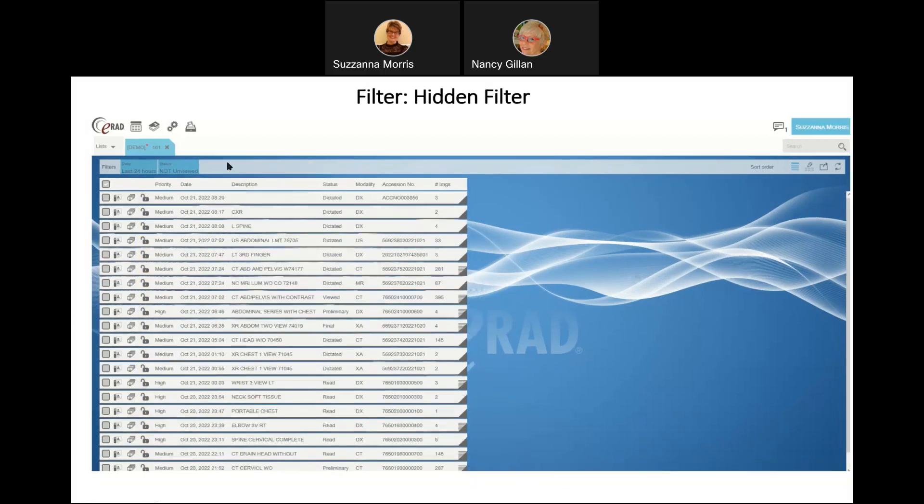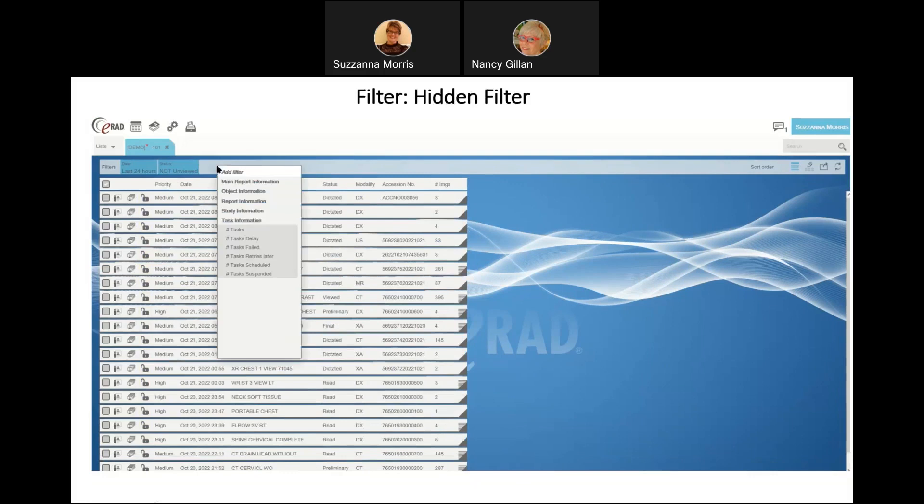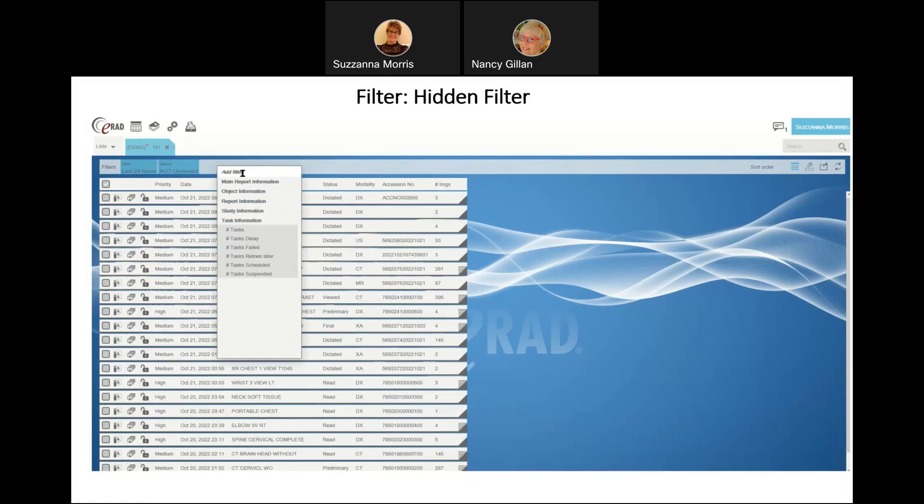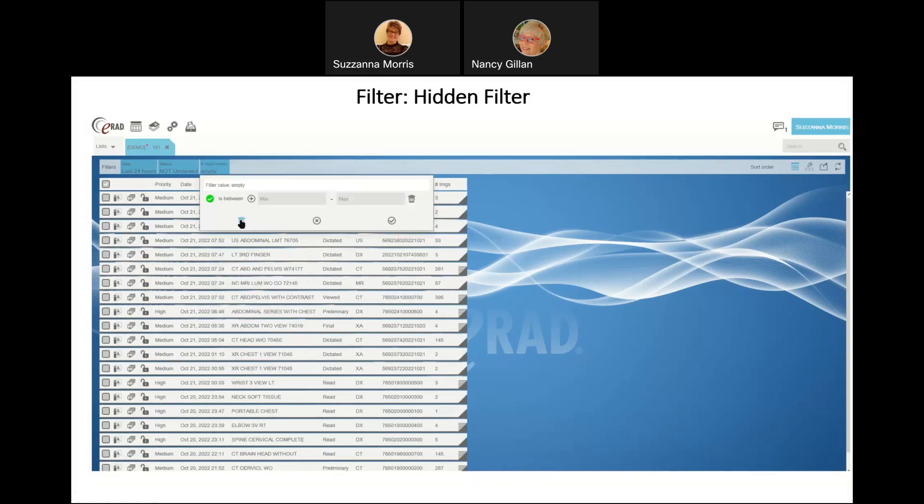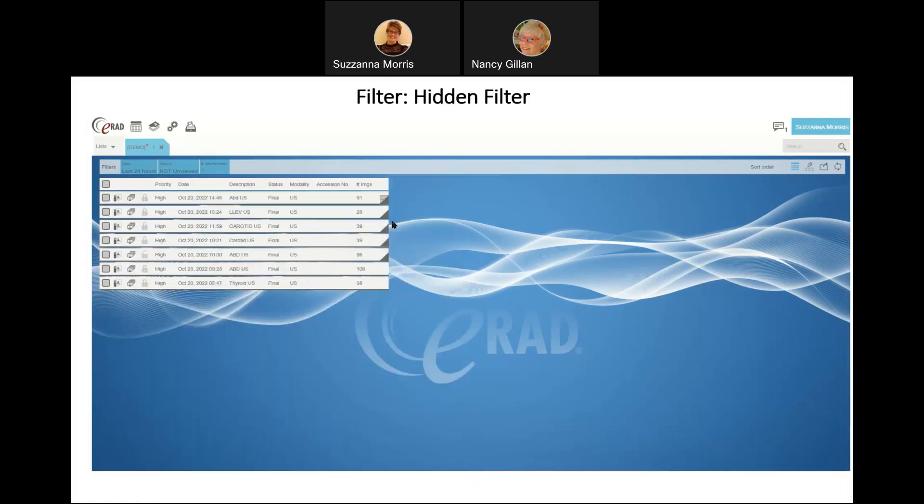You can also filter by hidden filters, which does not require you to have to open your layout editor. You come up to the top of your filter area and right-click, and you will get this drop-down list that shows you all the different things you can filter by. I'm choosing number of attachments, and it wants me to put in a value. I'm saying, show me everything that has at least one attachment with it, and that is how you query by hidden filter.